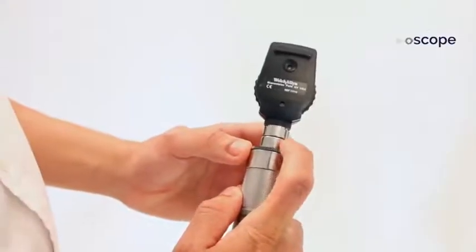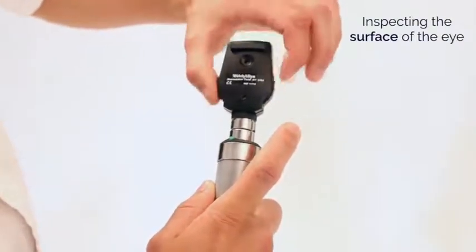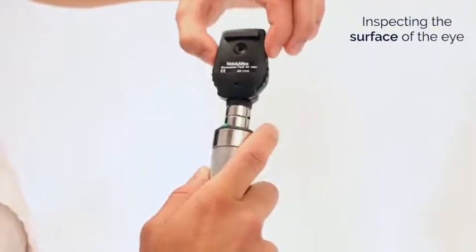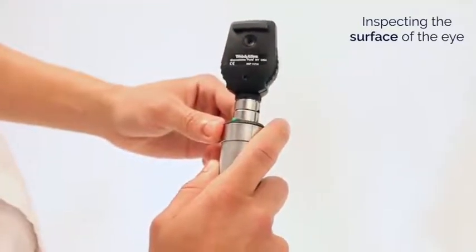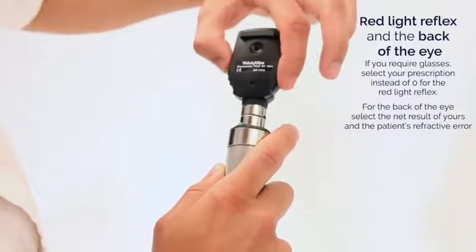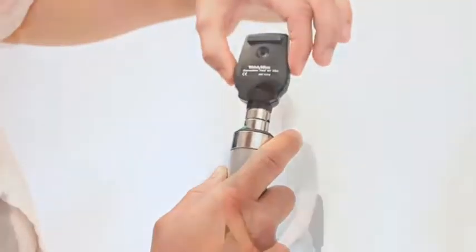To look at the front surface of the eye, you can turn the ophthalmoscope on and change the number in the dial to a green number that is high, either 10 or 15. That changes the ophthalmoscope into a magnifying glass to look at the front surface of the eye. To get the red light reflex, change it back to 0.